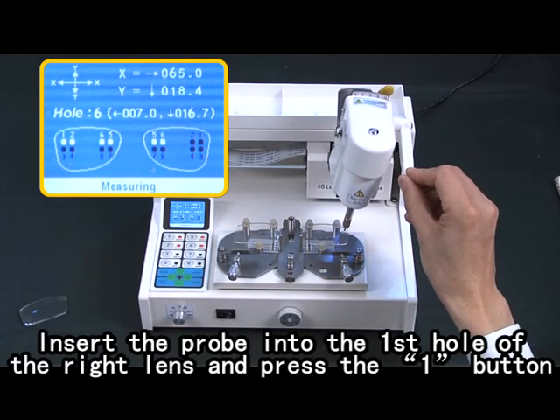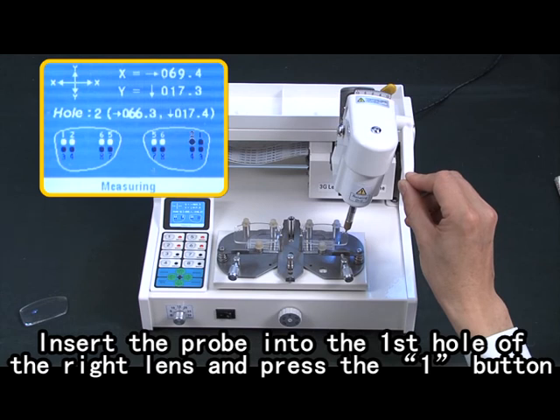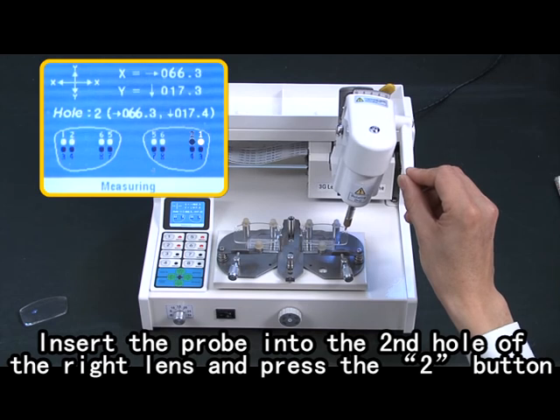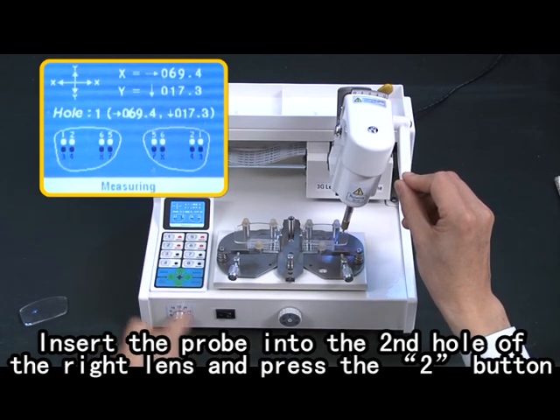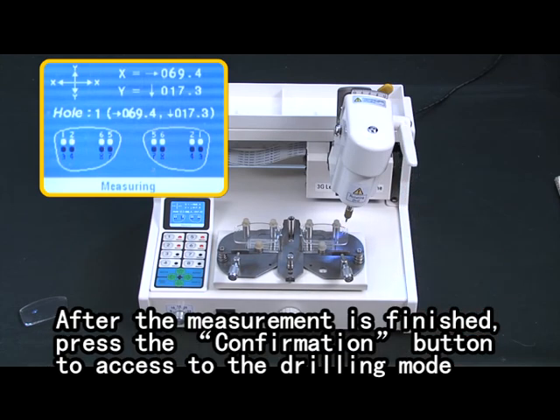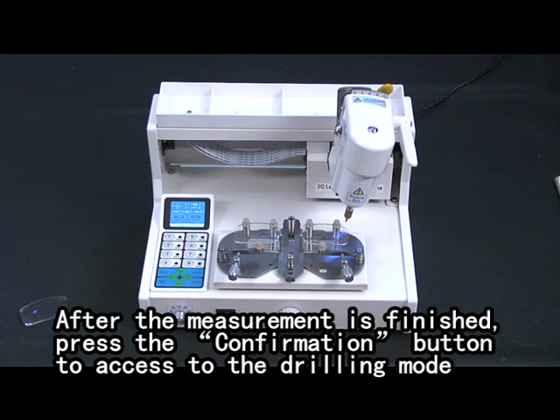Insert the probe into the fourth hole of the right lens and press the one button. Insert the probe into the second hole of the right lens and press the two button. After measurement is finished, press the confirmation button to access the drilling mode.